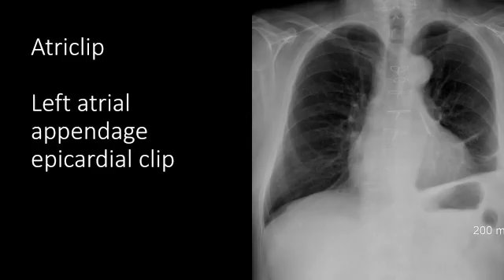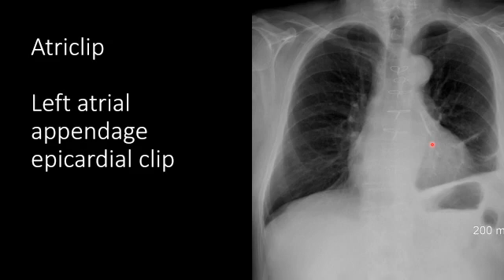This next image shows a patient status post median sternotomy with an AtriClip in place. This is a left atrial appendage epicardial clip — a type of atrial appendage closure device used to treat atrial fibrillation. It is applied epicardially with no foreign body contact with the bloodstream.